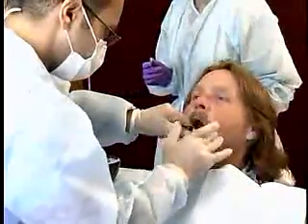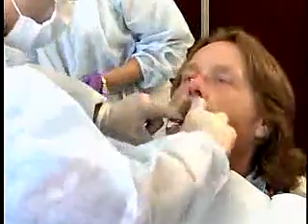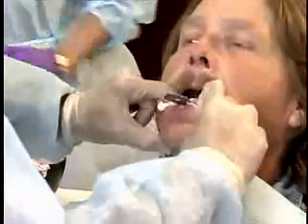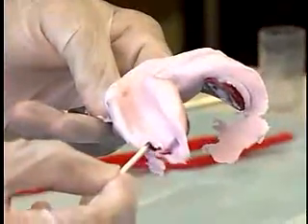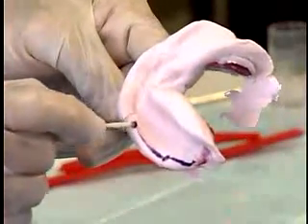The seating pressure is stopped, and border molding is performed so that the impression is not overextended. The tray is held in place until the alginate has completely set. Remove the impression from the mouth and inspect it to determine if it's acceptable.